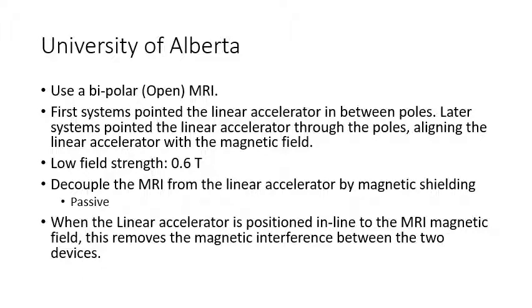It decouples the MRI from the linear accelerator by passive magnetic shielding. When the linear accelerator is positioned in line to the MRI magnetic field, this effectively removes the magnetic interference between the 2 devices.